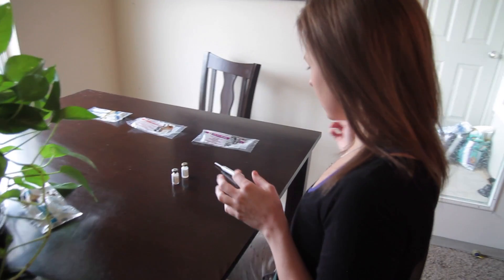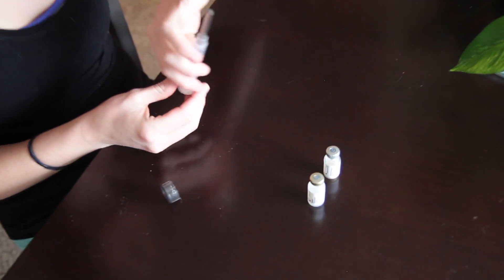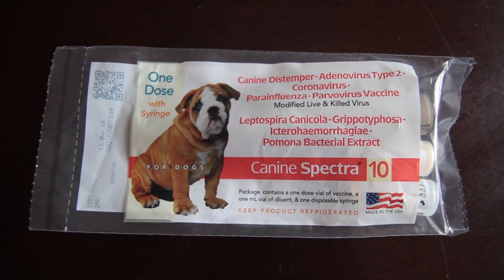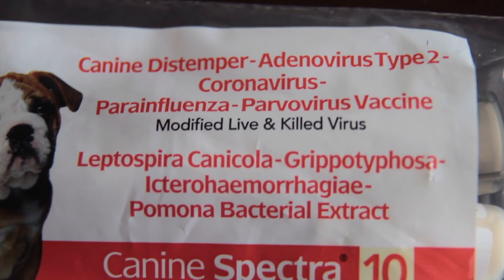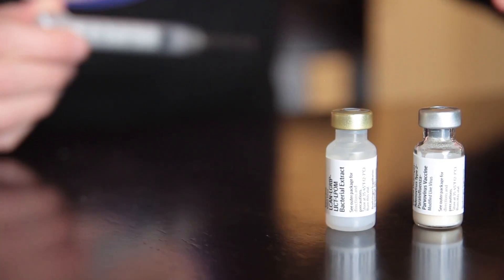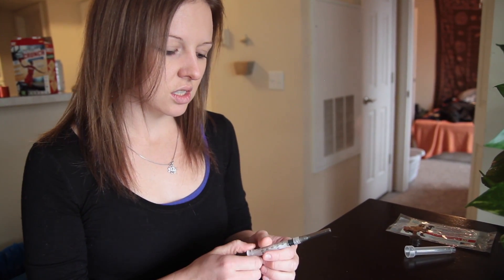We have to reconstitute the vaccinations. We're gonna stick Hannah first cause I think she'll be a good starter for me. I washed my hands — always wash your hands. This is the K9 Spectra 10, so it protects them from a bunch of different stuff. What we're gonna do is reconstitute the liquid into the powdery, then you shake it up until it's all reconstituted, and then you draw it up into the needle. Another thing I read is that you're supposed to pull back to make sure you're not in a blood vessel. As a nurse I do know that for IM injections, but this is supposed to be a subcutaneous injection on a dog. I'm gonna do it just in case.